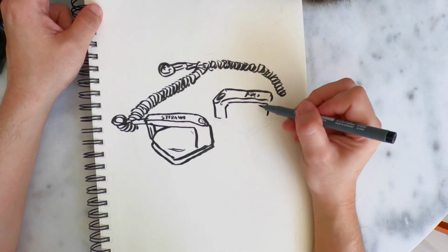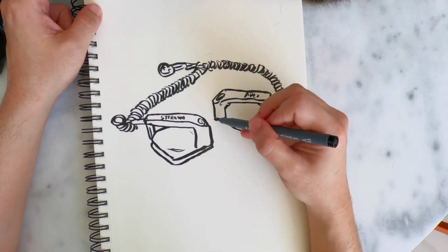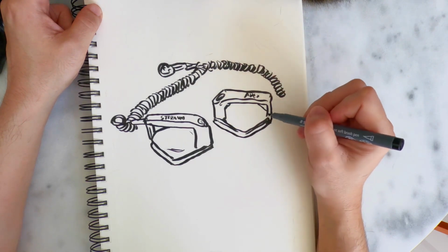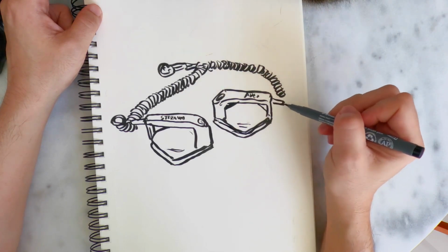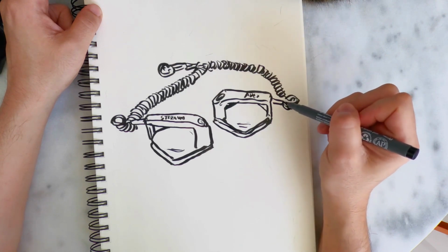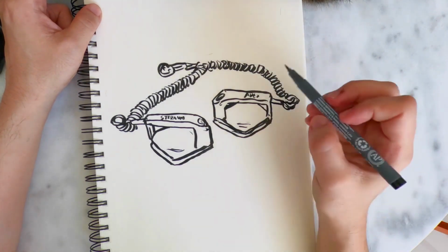In summary, the placement has specific positions. Specifically, for those of us who are basic users and not doctors or researchers, we should not move the positions of the pads. We shouldn't just place them wherever we think they should go. It's not like an electric shock where touching it can shock the whole body. The device is specifically designed to deliver shocks to the heart only. Therefore, the direction of placement is very important.